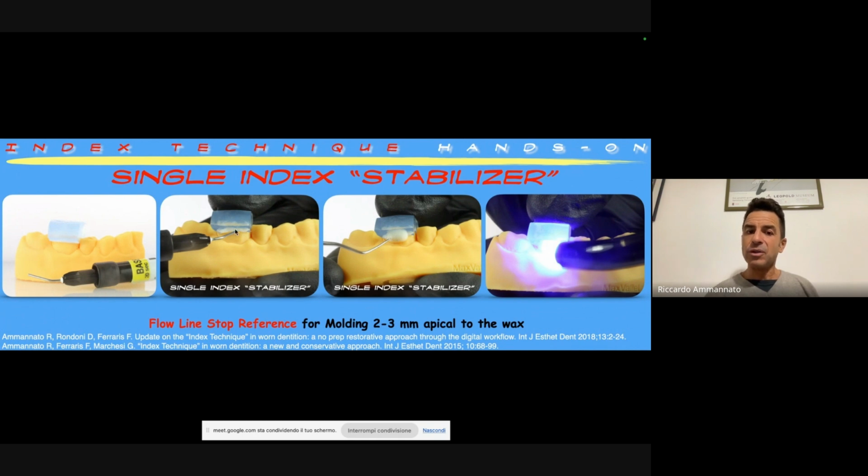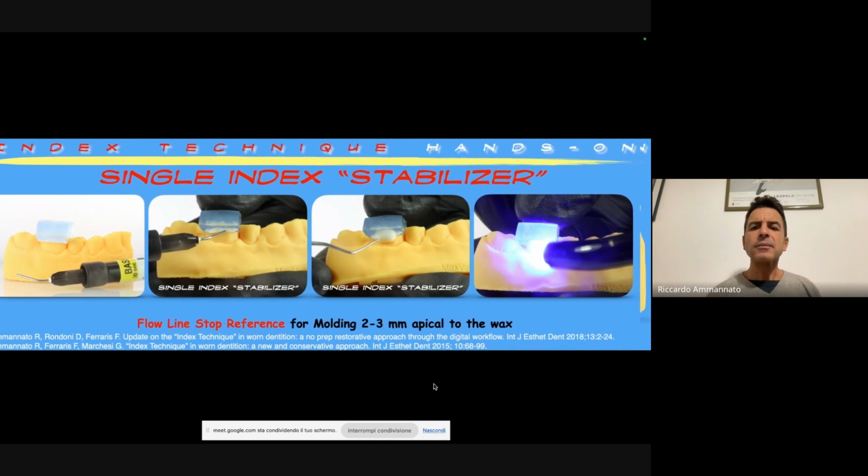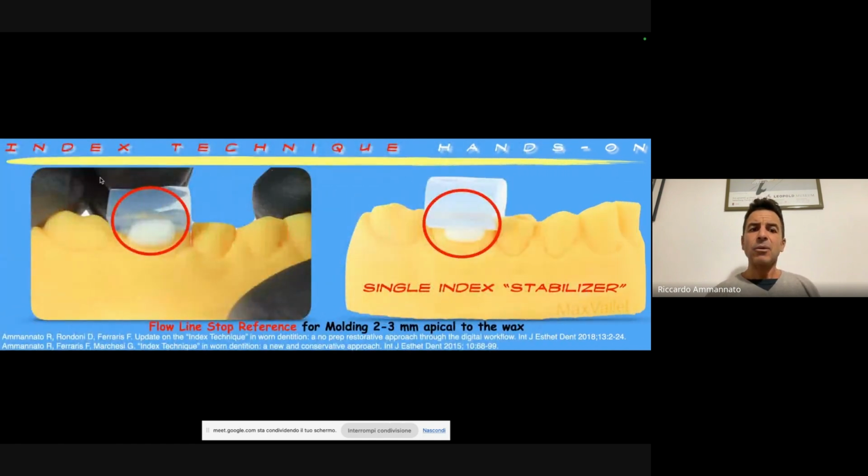With some flow, you see the index here on a model, we place our flow, we cure it, and then after that, we just check again whether our index is kissing our stabilizer correctly, so our flow line stop reference, and you see it also here. So the stabilizer leads to two advantages.